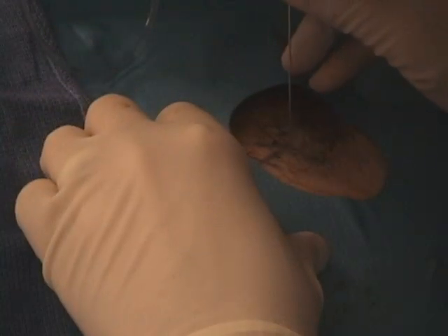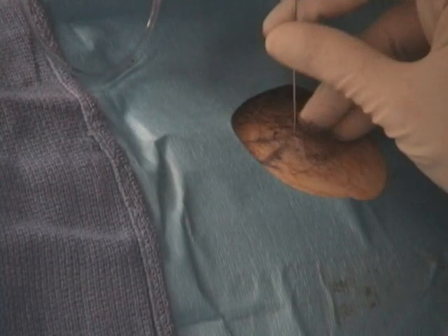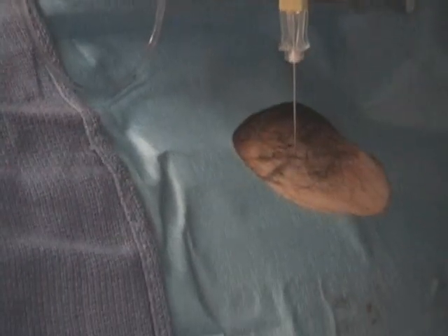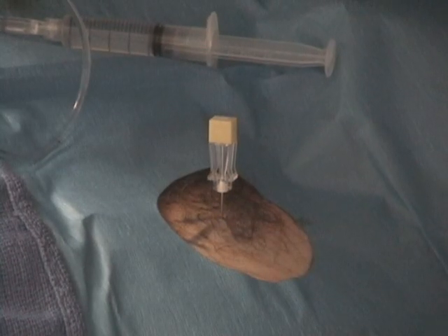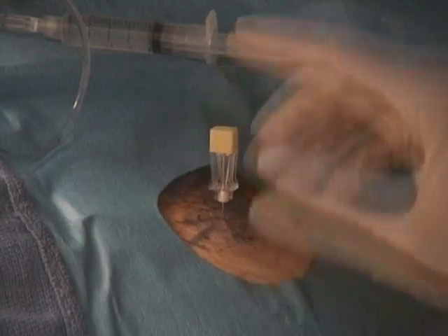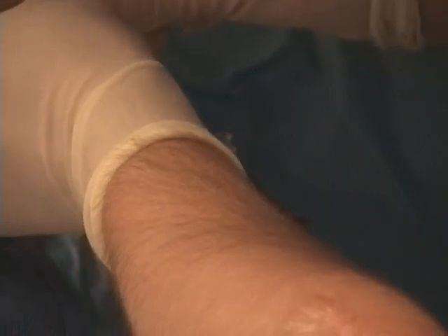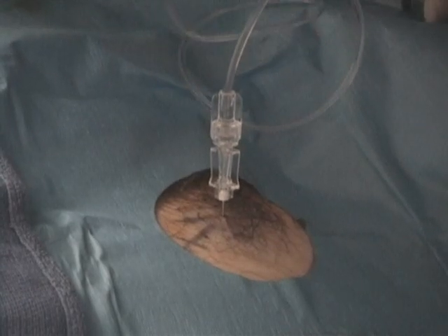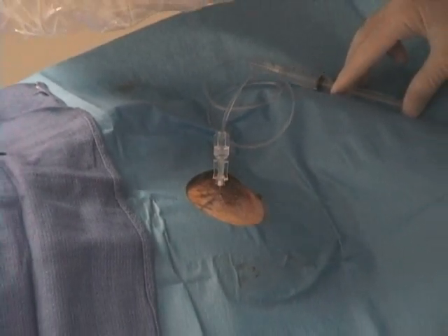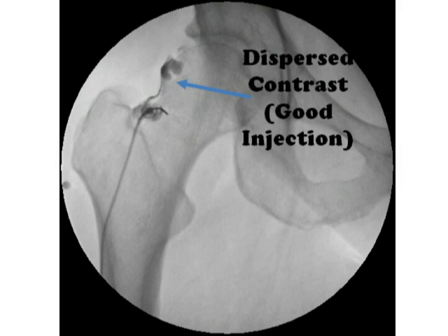Advance the spinal needle a small amount underneath the skin, and then check your needle trajectory under fluoroscopy. Adjust the path of the needle if necessary, and then advance the needle until it contacts the femoral cortex. Once you've contacted the femoral cortex, you can remove the inner stylet and, in a similar fashion, connect the tubing. Again, make sure you evacuate the air bubbles by dripping in a small amount of contrast first. You can then inject a small amount of contrast and check under fluoroscopy. In this case, the contrast has again dispersed away from the needle tip, which indicates a good injection.